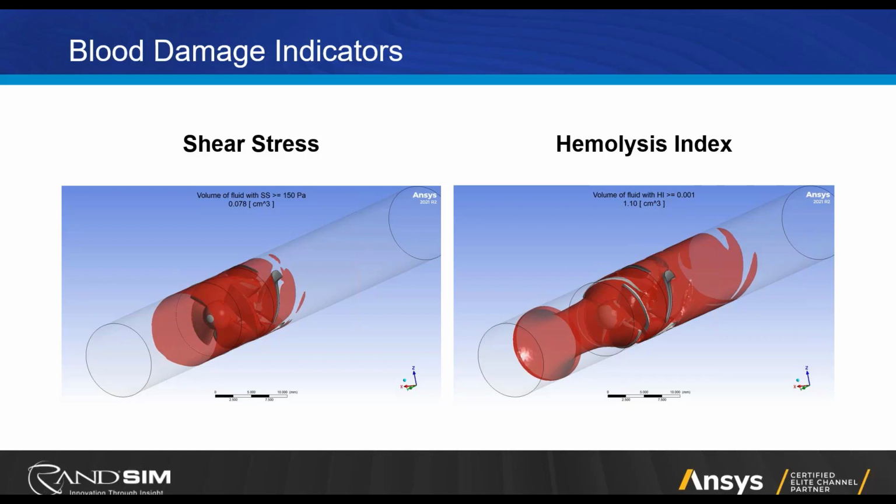So again, to reiterate, hemolysis may be new to some people. What it does is include the time variable, not only the shear stress value that the blood is exposed to, but how long the blood is exposed to that shear stress. And that's why you see the larger area upstream of the impeller and also in the wake region of the diffuser, these areas of concern predicted by the hemolysis model. Next slide, please.